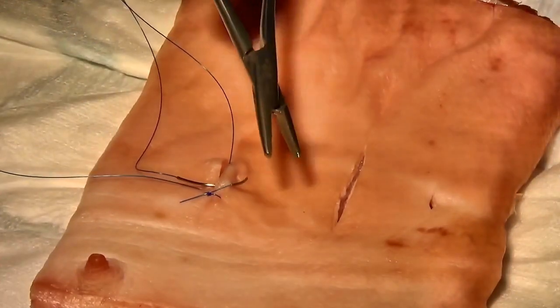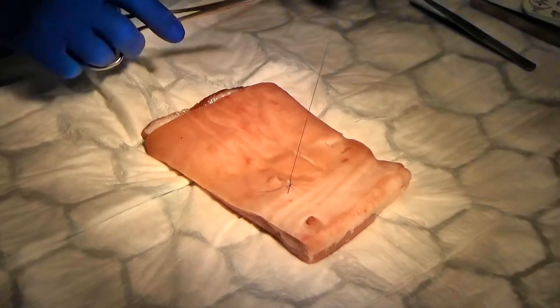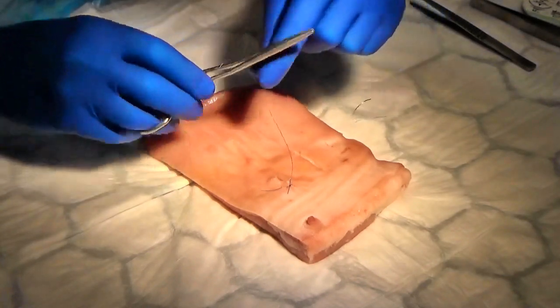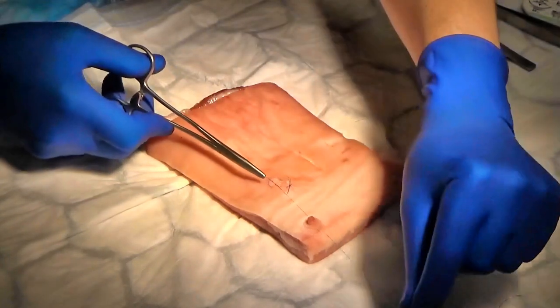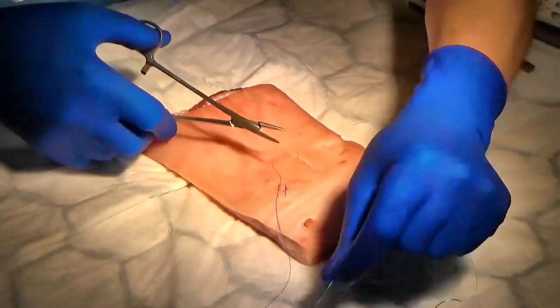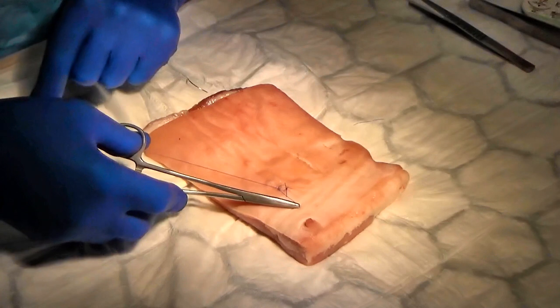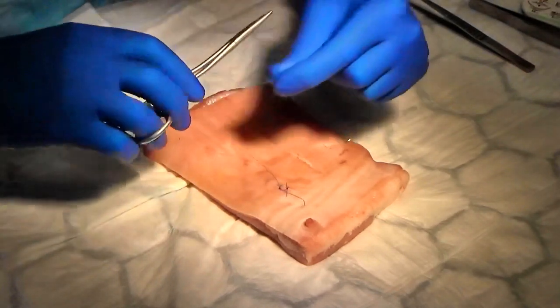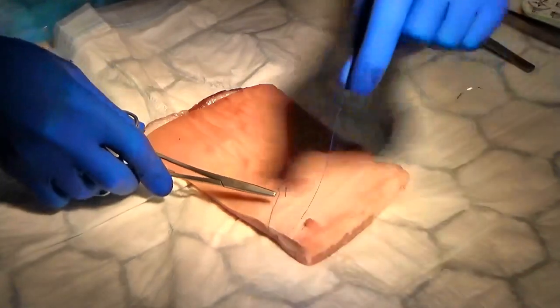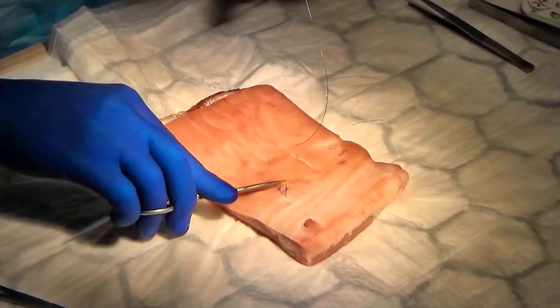Come through and we'll do the knot tying again, once, twice clockwise, anti-clockwise, put the knot over to one side, and again clockwise. And cut your suture.